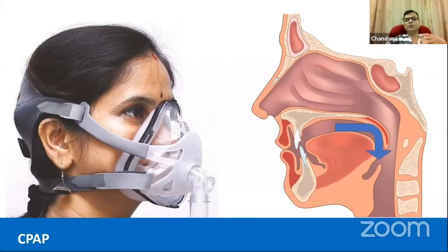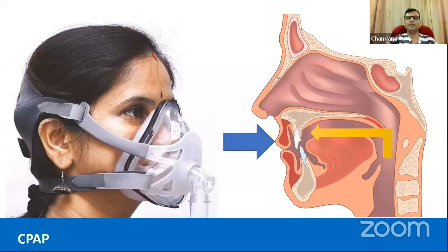So when the patient breathes, the pressure is applied at the oral airway opening. We use a tight-fitting mask and a device to pressurize gas, and we maintain a certain pressure. That pressure will help inhalation or inspiration. But when the patient tries to exhale, that pressure will not change, but will still be there. So the patient will have to use a certain degree of higher force to exhale than in a normal situation, like when the mask is not connected.